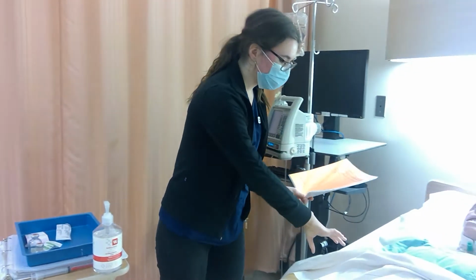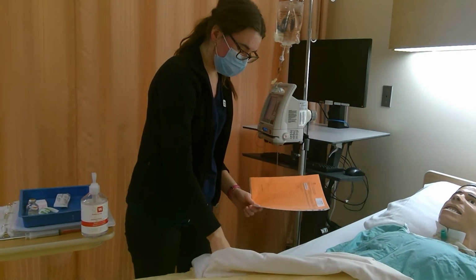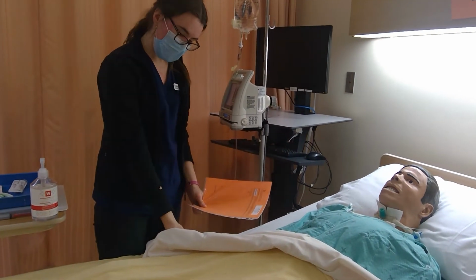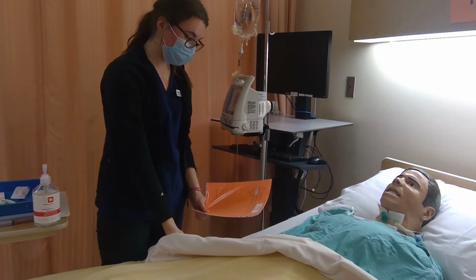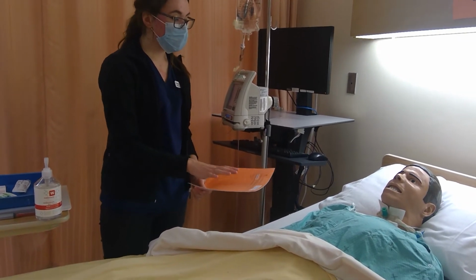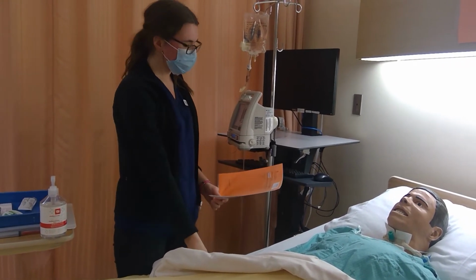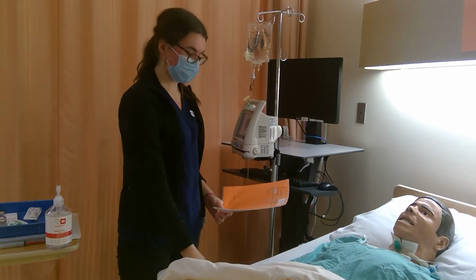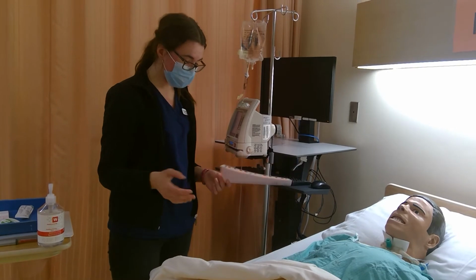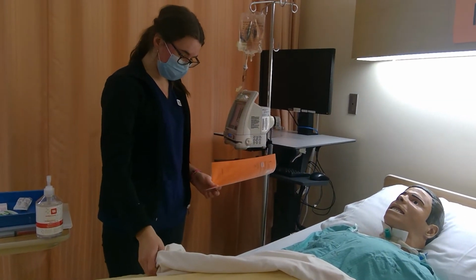And so if you don't mind, first thing we're going to do, can you just state your name for me? And he says, my name is Valdez Vox. I'm like, great. And when were you born, Valdez? October 19, 1990. And so I see that that matches with our MAR, so that's all good. And Valdez, are you allergic to anything? Walnuts. Awesome. That's what we have on here, and that's something that we also would check before in the med room. So we have that allergy check done.